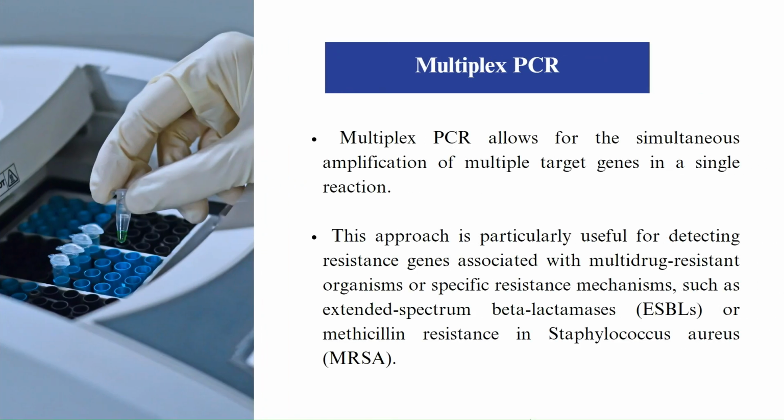Multiplex PCR. Multiplex PCR allows for the simultaneous amplification of multiple target genes in a single reaction. This approach is particularly useful for detecting resistance genes associated with multi-drug-resistant organisms or specific resistance mechanisms, such as extended-spectrum beta-lactamases, ESBLs, or methicillin resistance in Staphylococcus aureus, MRSA.